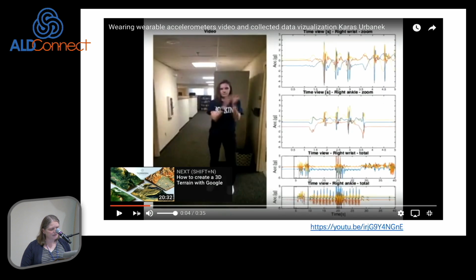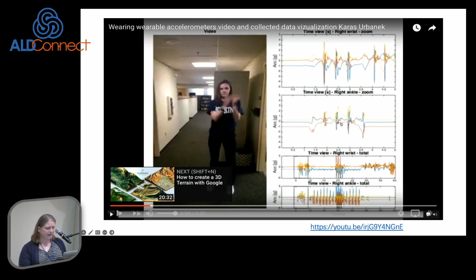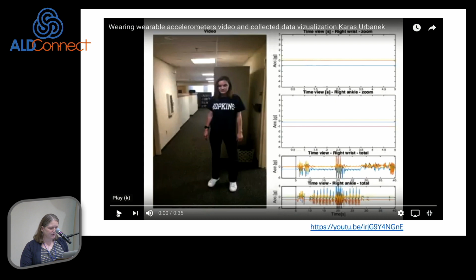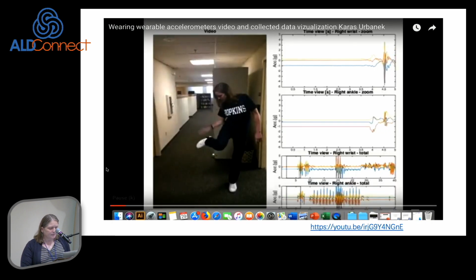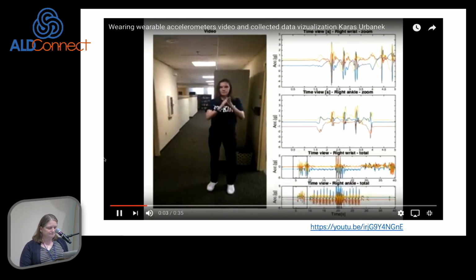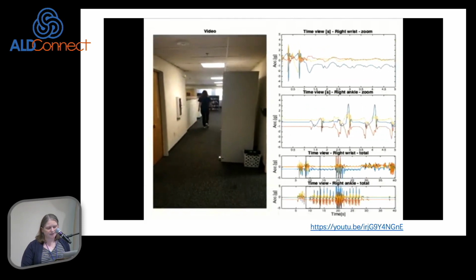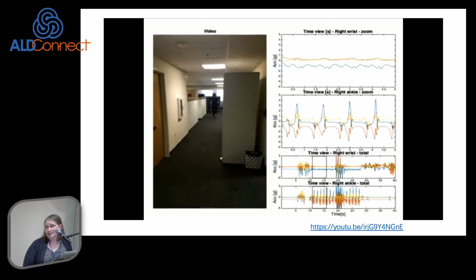And I'm just going to show you here in this video, the student is wearing accelerometers on her wrists and on her ankles. The top tracing is her right wrist, and the right ankle is below that. You'll see when she's doing different activities how we get different information from the devices. When she's walking, you see more activity coming in the bottom tracing for her foot activity.